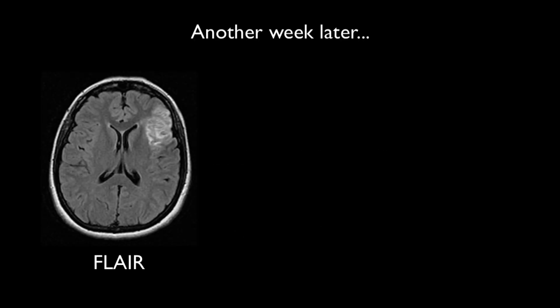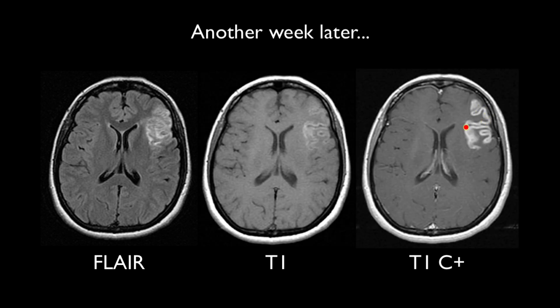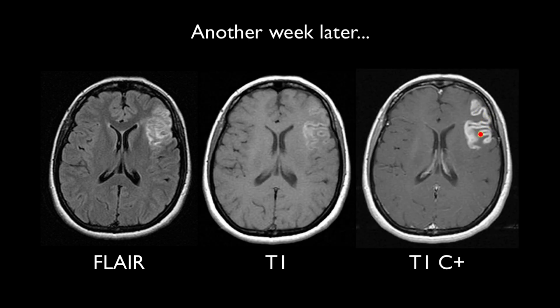If in doubt of the diagnosis, the easiest way to confirm that this represents CT fogging is to administer contrast, as the cortex will usually demonstrate vivid ribbon-like cortical enhancement. Alternatively, an MRI can also demonstrate similar features. This same patient was scanned a week later still with MR, and demonstrates the vivid cortical enhancement on post-contrast T1 sequences.